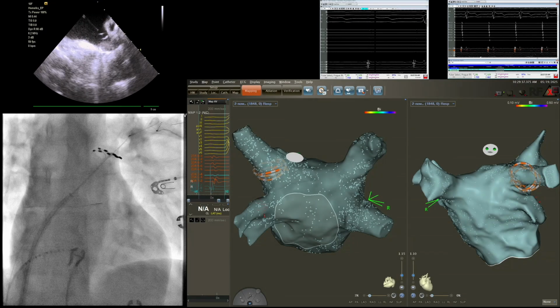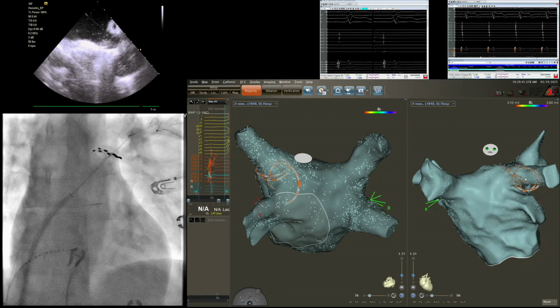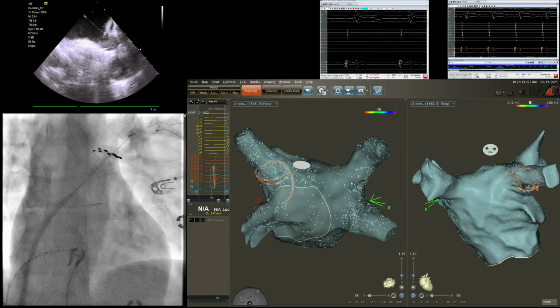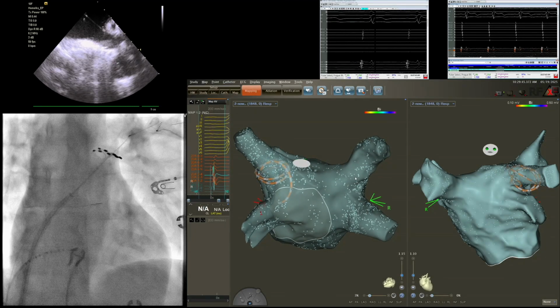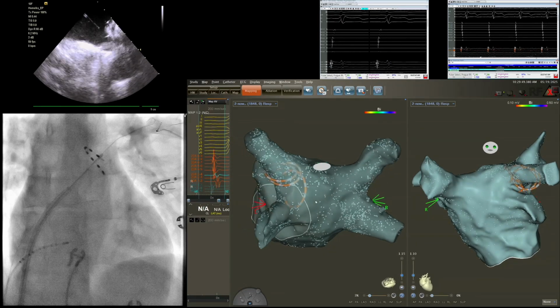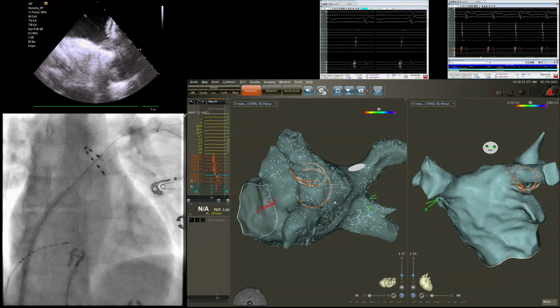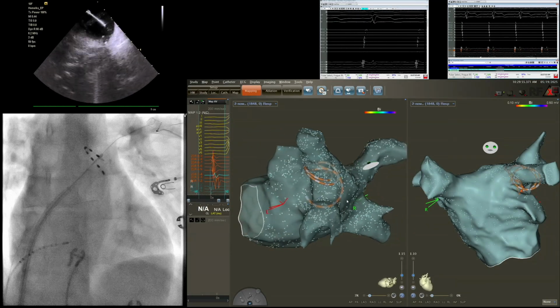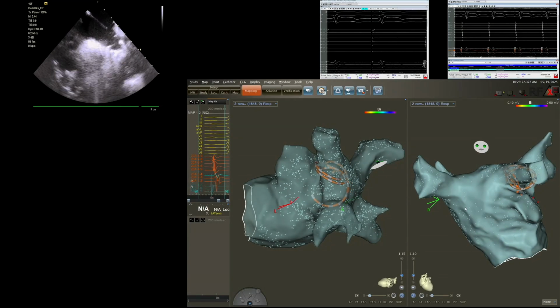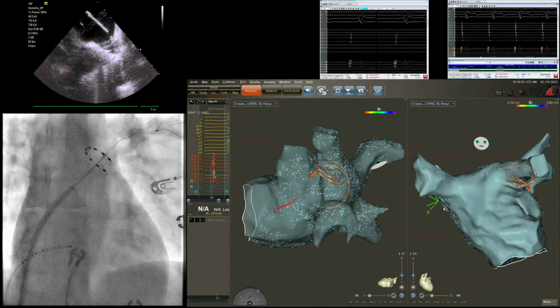Okay, so now we are ready for another rotation. I would not rotate too much, because it was too much, maybe. Fine. Okay, it's perfect. Peter, with the rotations, we're seeing some signals go by. You're searching for the signals? I'm always looking at the signals, and I'm trying now to be a little bit more outer, okay? And we see signals now. Yes. Okay, because I'm a little bit outer.